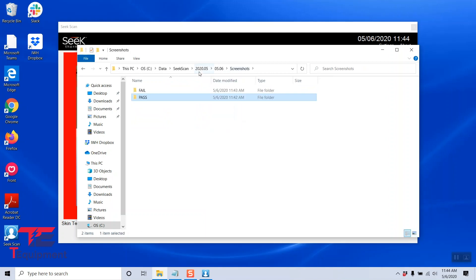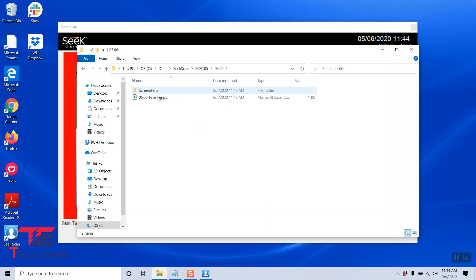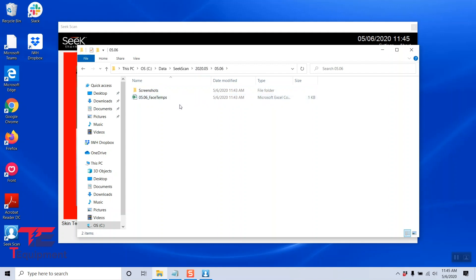You may have noticed that in the Seek Scan folder, after you go into the year and the month and the month and day, there's also a face temps Excel file here and a CSV file. This one will actually give you a log of the temperature readings. So we're going to go ahead and open this.